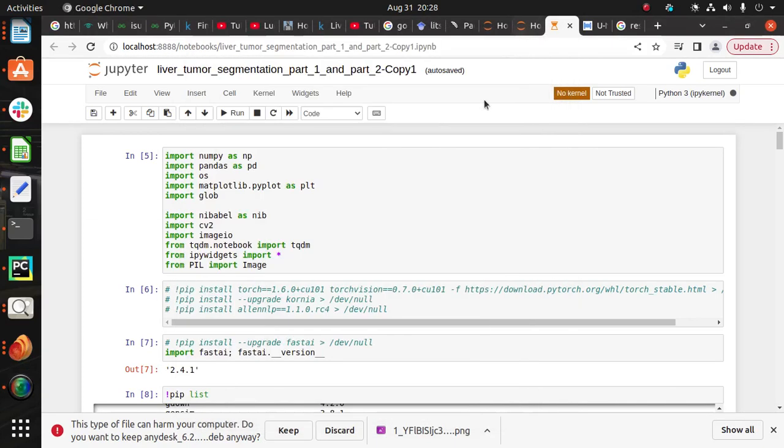Hello everyone, so today's topic is liver tumor segmentation using ResNet and the U-Net model. First of all, we have to collect the dataset. I collected the dataset from the Kaggle website, and the primary source of information is the LITS.